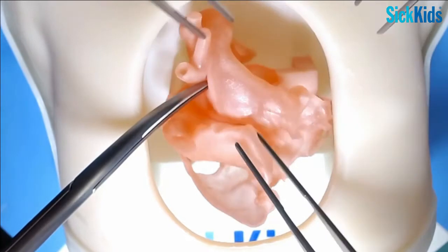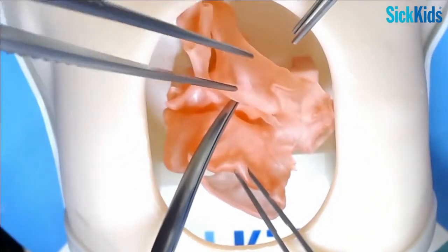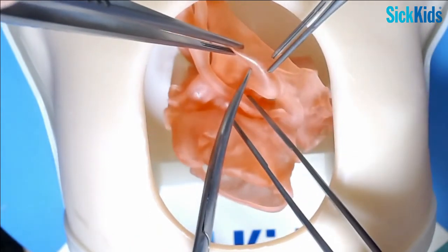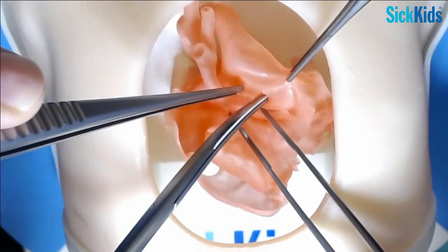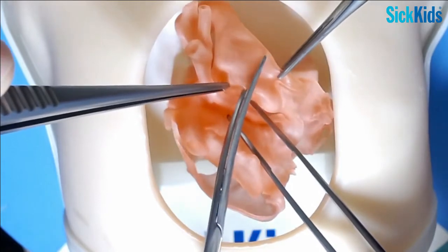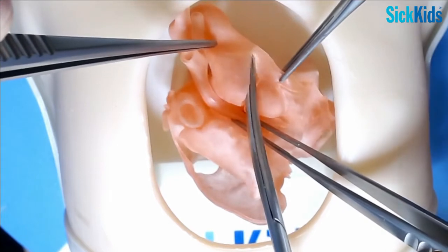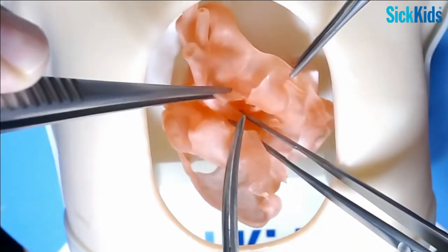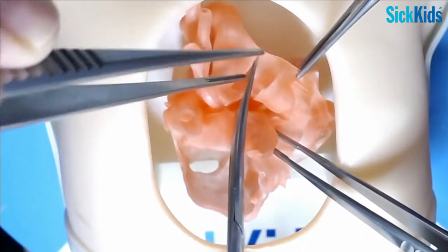In terms of transecting your pulmonary artery, usually you have to mobilize tissue here, and then you can cut right at the orifice of the right pulmonary artery or right on top, and you want to look inside and make sure you're not cutting the pulmonary valve. Obviously that seems obvious. The other thing is you want to angle a little bit leftward, and there's plenty of PA there, so see how I'm angling towards the head, and then come around the back without compromising the orifice.